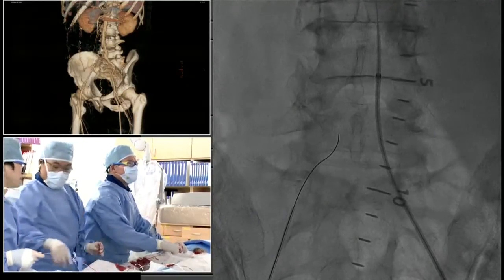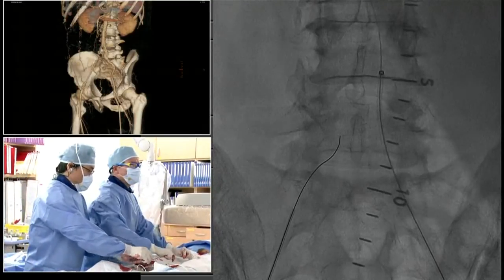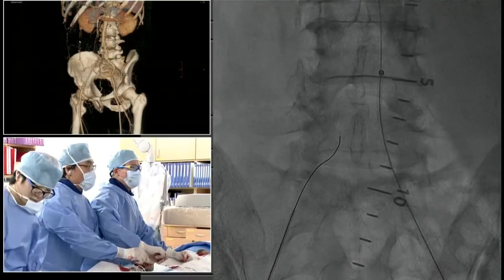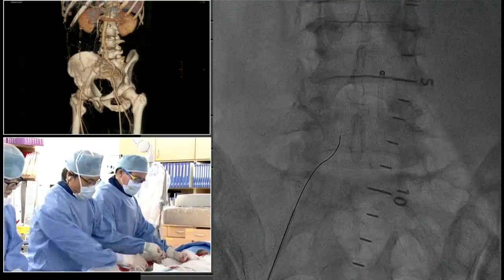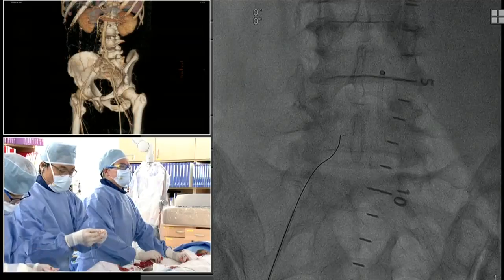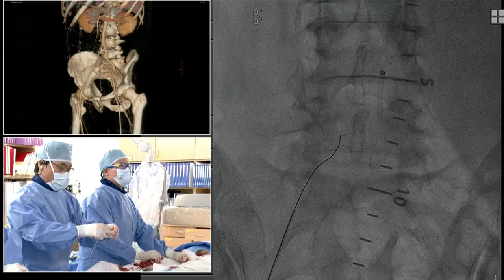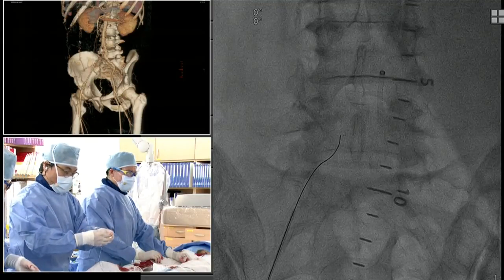The data would suggest that if you can cross from above, you have a better chance of succeeding and staying intraluminal. Yep. So I think an approach from contralateral from above is a good idea. Although the challenge is always getting enough backup support to get the wire through. I'm surprised that we've had as much backup support as we have because I didn't think we would. We actually had pretty good backup support, so I'm a little bit more optimistic.